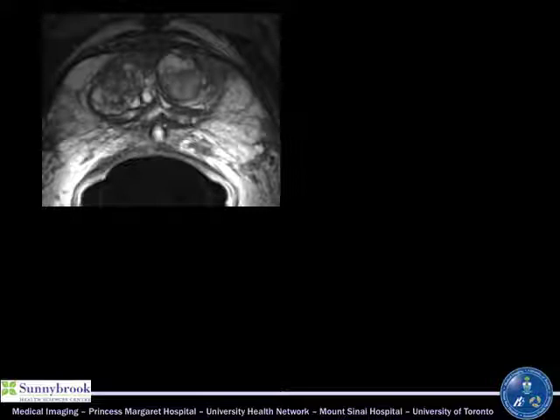So here's a patient, and I'll go through a little bit of anatomy because we don't have primarily a radiology audience here. So this is an axial image. This is the endorectal coil that we use. Now we don't use this in all patients now. We moved away from this on 3T imaging. The peripheral zone is this bright stuff here, sort of C-shaped, I guess with Movember coming, we'll call this mustache-shaped area of the prostate. This is a little prostatic utricle cyst. Left ejaculatory duct, right ejaculatory duct.